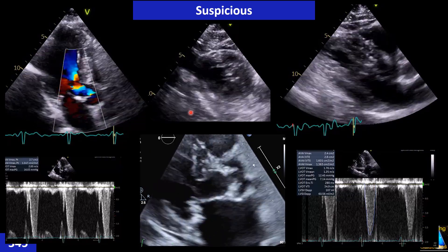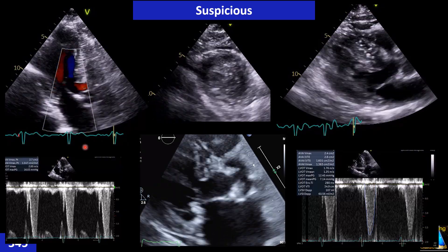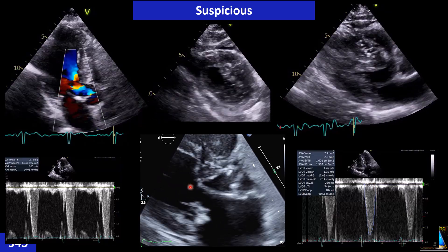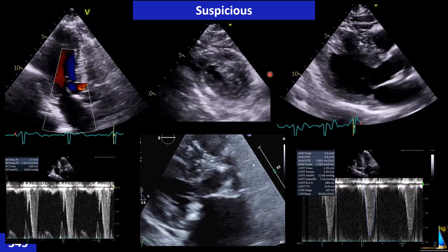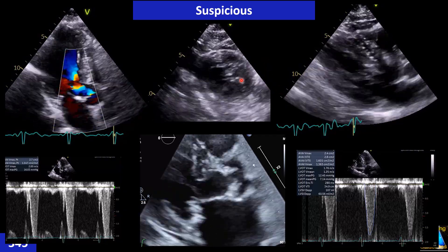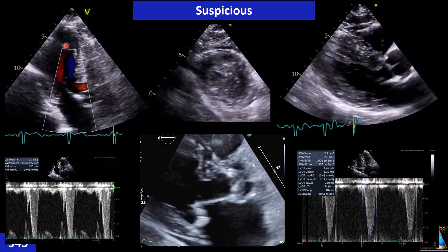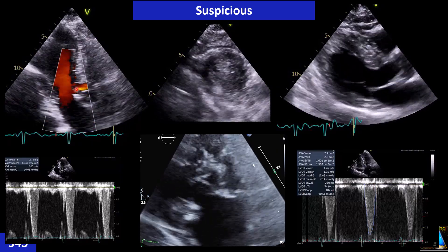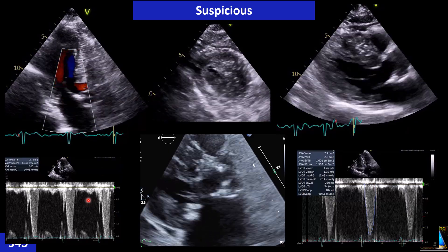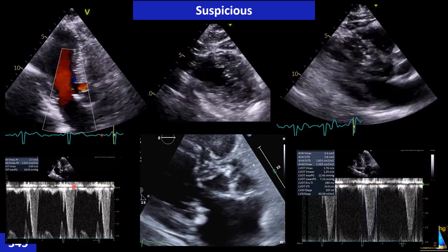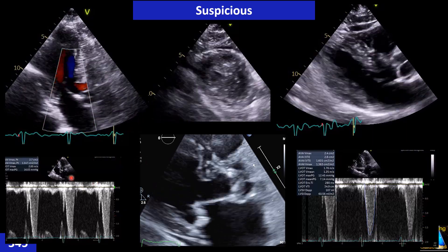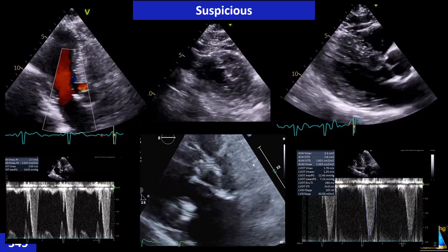When we scan these patients and see hypertrophy — symmetric, asymmetric, apical, septal, or even prominent sigmoid — and the indication is presyncope, or we see aliasing in the left ventricle on color Doppler at the LVOT level, or a PW sample on the LVOT shows velocity over 1.5 m/s, we always have to think about HOCM. In any of those situations we need to perform Valsalva.